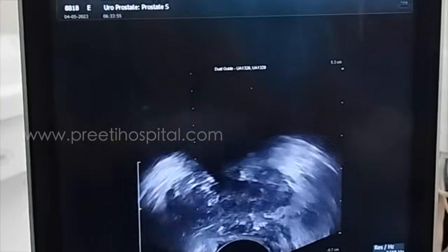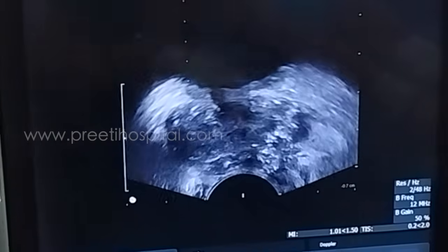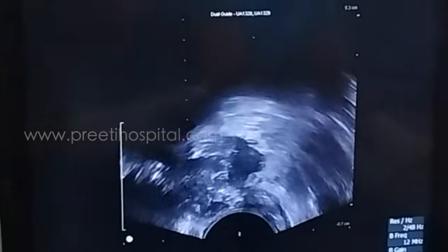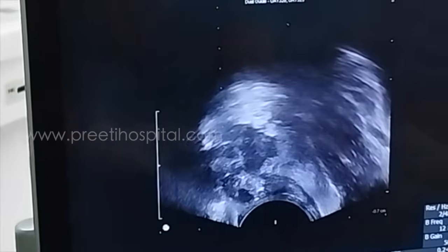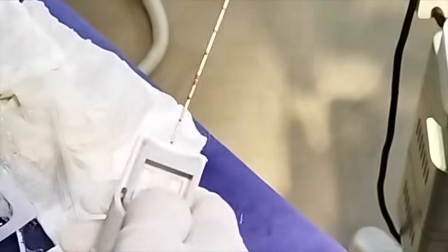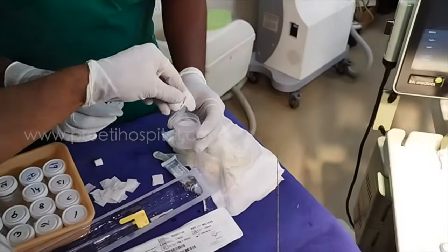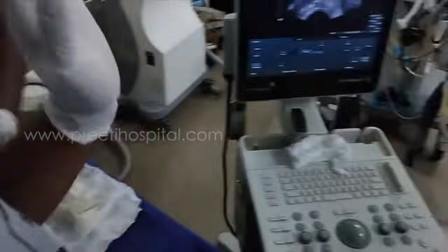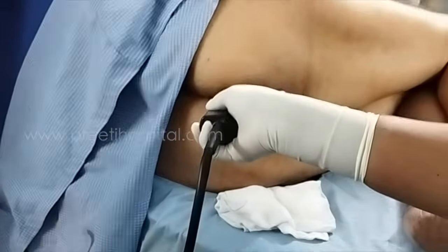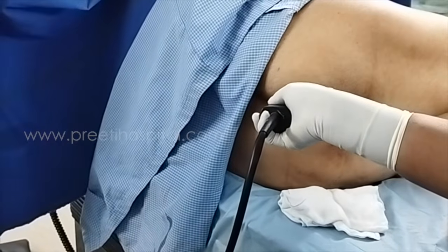We will write down all you have taken. All you have taken is right side, no? So right only you take. Come down. This confusion will be there only in end firing, opposite will be there. Fire. This is anterior. So you wanted to take 3 more on the left side. Now this is right side, 3 ways, axial, middle part of the base. Now we will take the left side three.